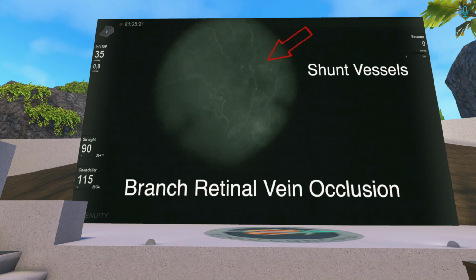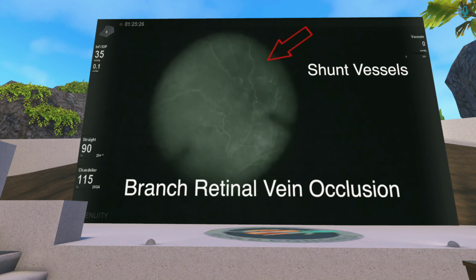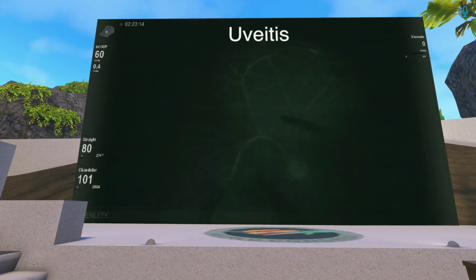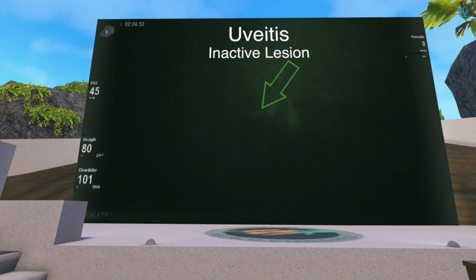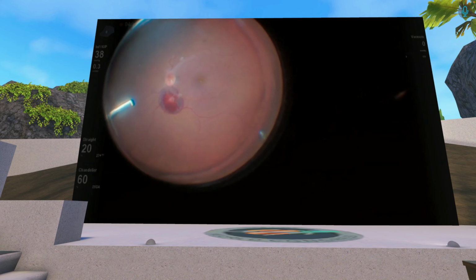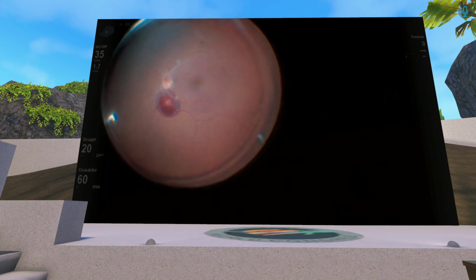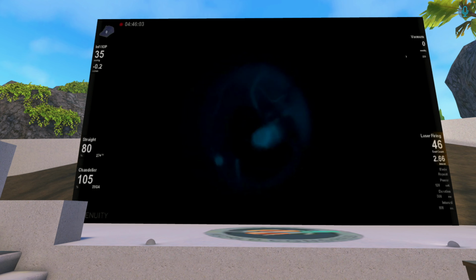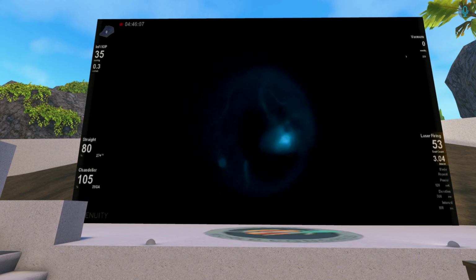So this is just showing the detail that we can get, in a little bit of a grayscale video. This is an eye with uveitis. And we saw some vasculitis, but the big lesion superiorly that we couldn't see before really didn't look all that active. So this patient got some post-op steroids, but wasn't hammered with it, and wound up doing well. We thought it was sarcoid based on the intraoperative FA.